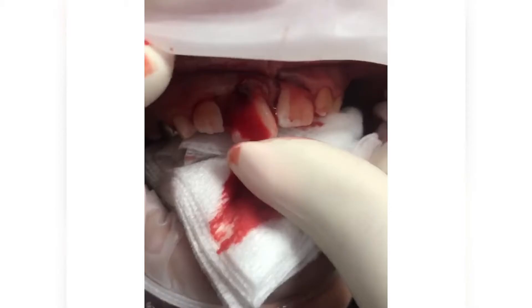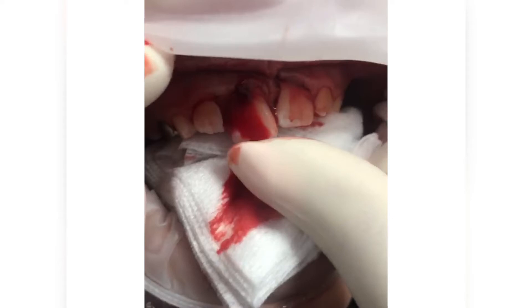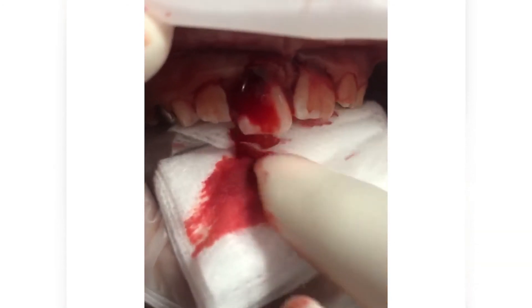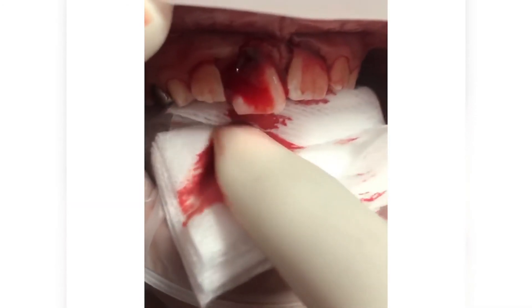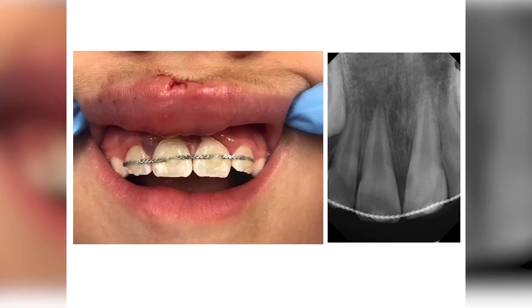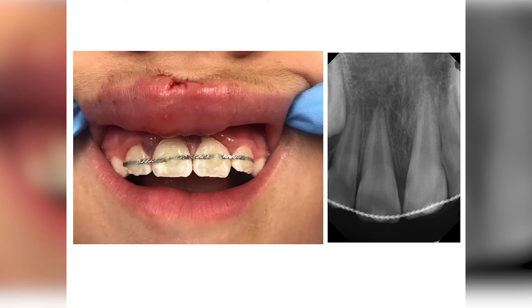Here you can see Dr. Delia Tuttle gently repositioning the tooth. A flexible splint was placed, and the patient was asked to return in two weeks for a recall.